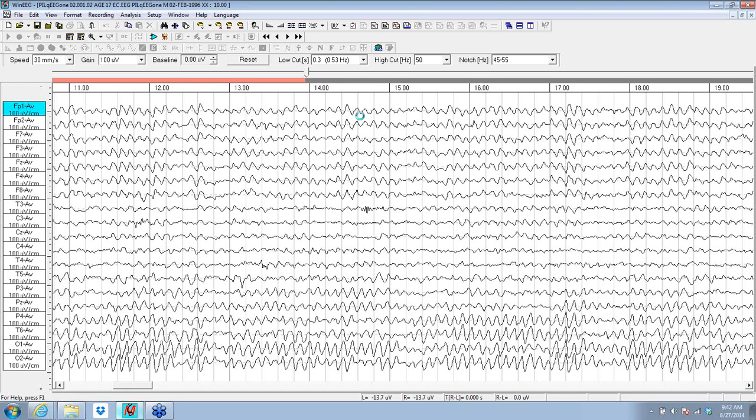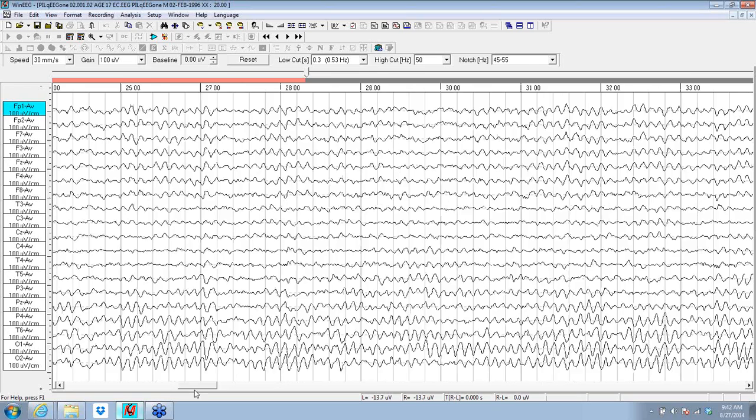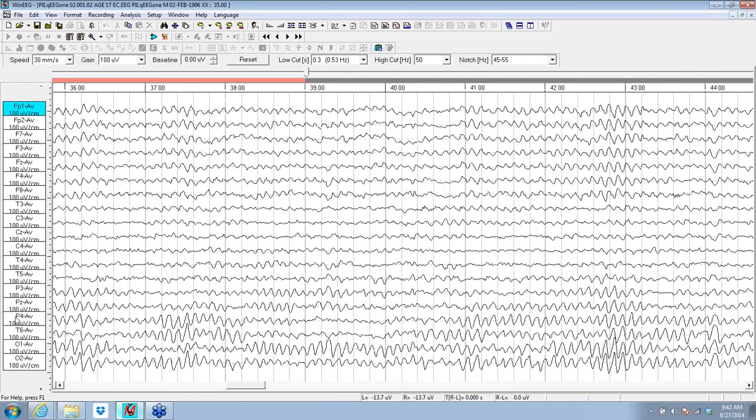If you look, the alpha up front is extraordinarily stable. In the back of the head, you expect alpha at O1, O2. But if you look carefully, this T6 has a rip-roaring amount of alpha going on there. So we've got an alpha intensity right temporally. And when you average all that out, that T6 is going to stick out. You expect alpha at O1, O2, but you don't expect intense alpha at T6. So that may stick out in a database comparison even more than the O1, O2. The z-scores may focus you on this, but you should have seen it already.